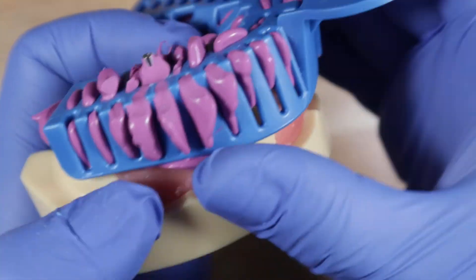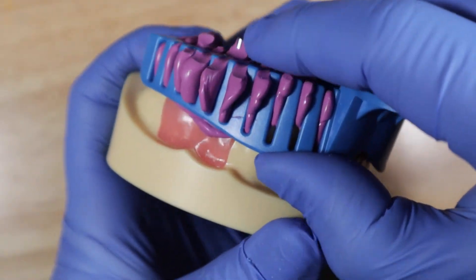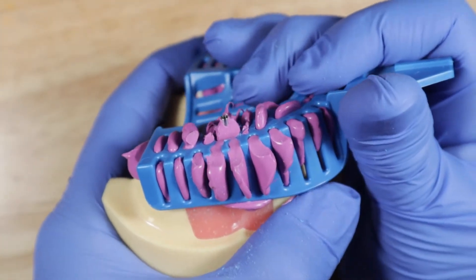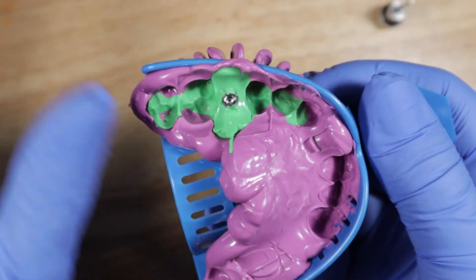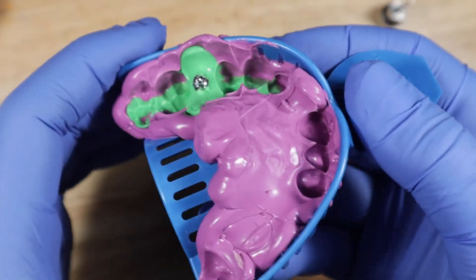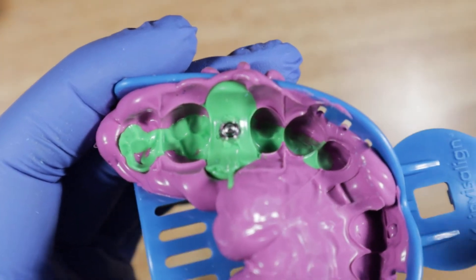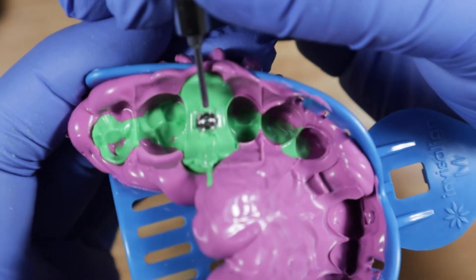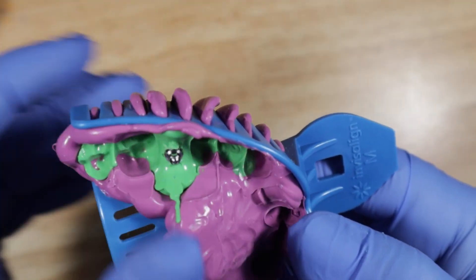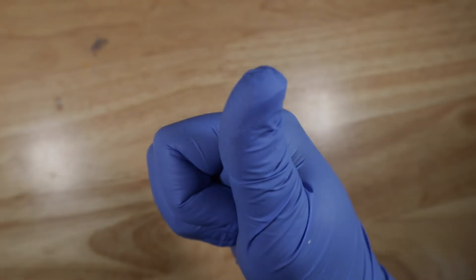Give it a strong tug on the sides, the front, and the other side — tug on all sides so you're not putting undue strain on any teeth — and pop it off. There's the light body that wrapped around the impression coping, and there's the heavy body. The important part is that this impression coping is completely immobilized by the impression material. As long as it's immobile, your lab can throw an analog on there and do the restoration. Pretty straightforward — you've got this.